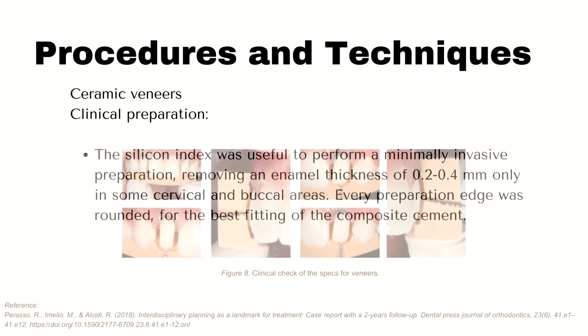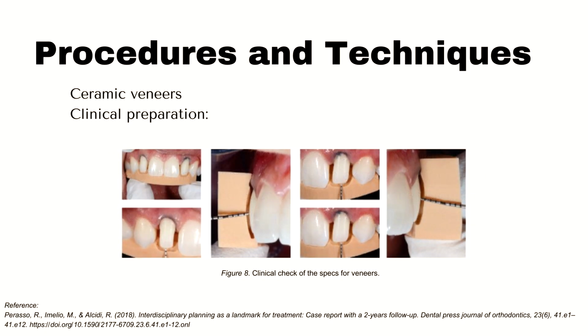This is what I've mentioned. This is the silicon index. The use of the silicon index will help you ensure excellent control over many aspects during treatment, especially in making tooth preparation for veneers.